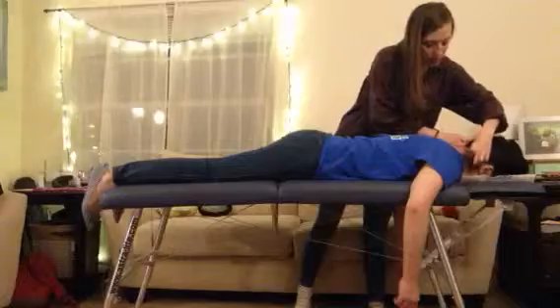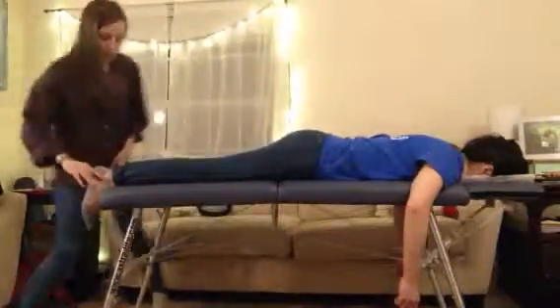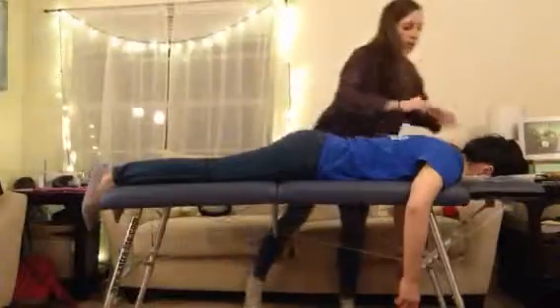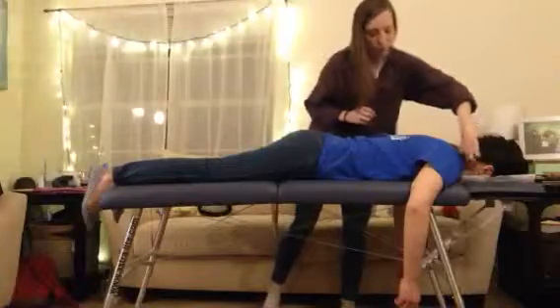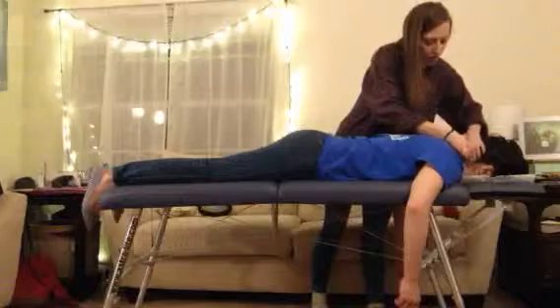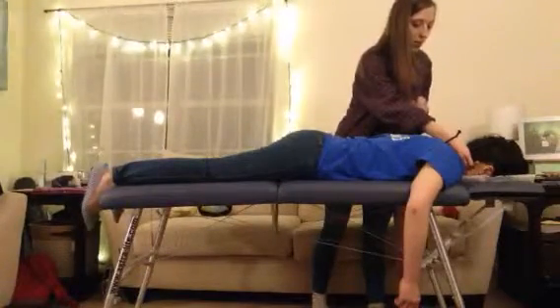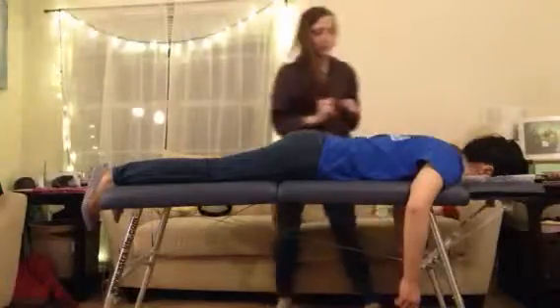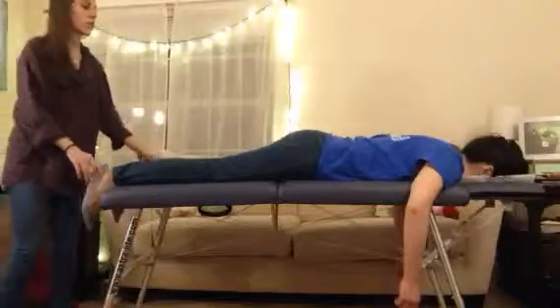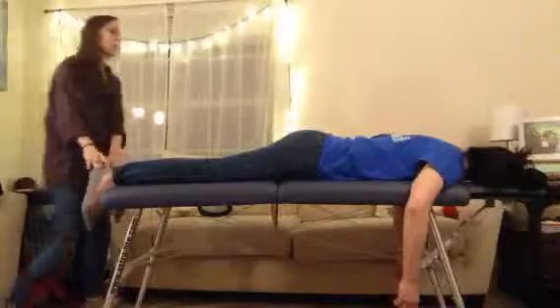So we're just going to pressure test lateral to medial on that TP, and then go back and check the legs. Okay, and if that balanced, then we'd go and check for torque, right or left torque, and whatever balance is what you would set your integrator to. And then just on that lateral TP of C1 on the short side, you're going to go straight lateral to medial with or without torque. Just whatever balanced. Okay, and then we're going to get her turned to the long side and then check the legs again. If that balanced, then come back to center.